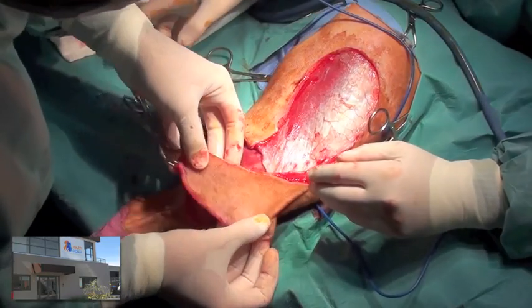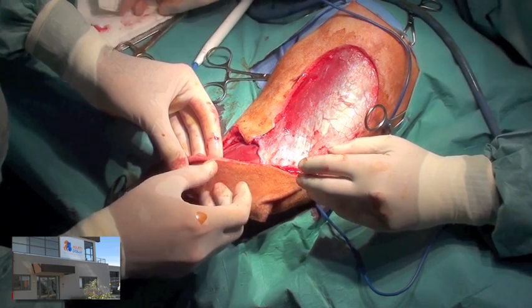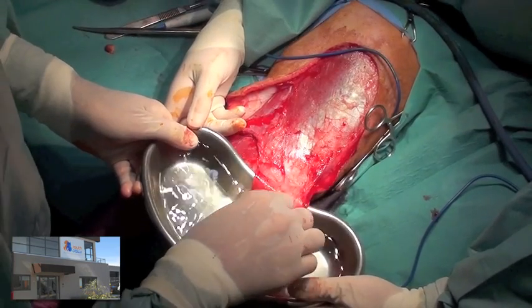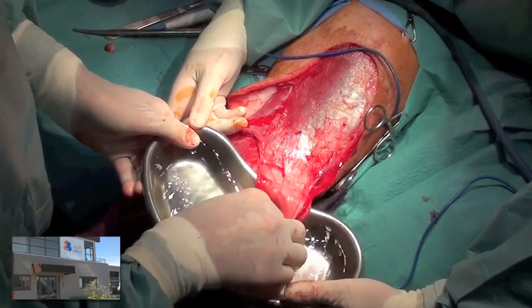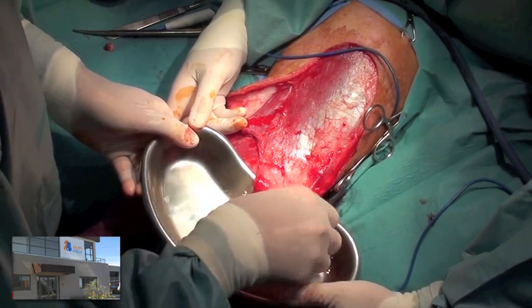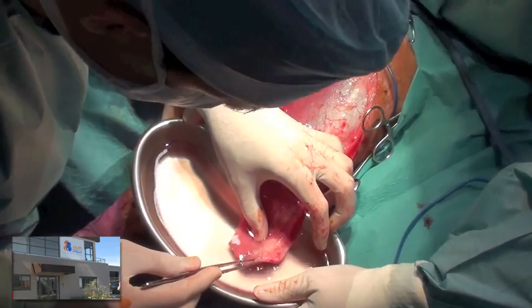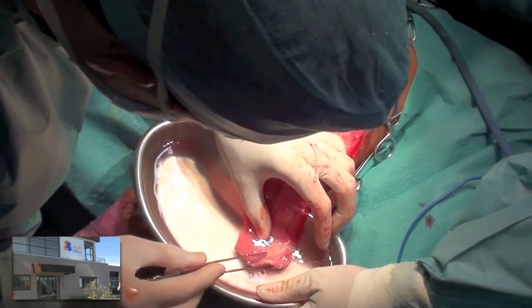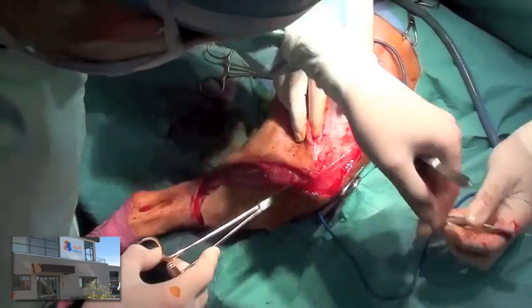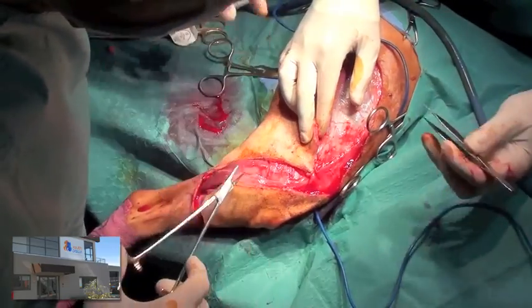The flap is then moved into the recipient site to confirm that adequate coverage will be provided. It was soaked in warm saline with lidocaine added in order to cause vasodilation. After this was performed, we could see that the edges of the flap started bleeding. Closure was performed in two layers using 3-0 PDS in a simple continuous pattern.